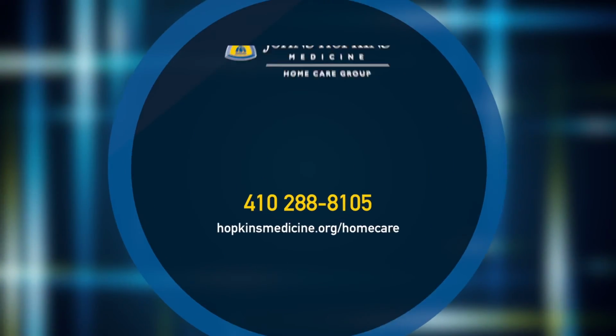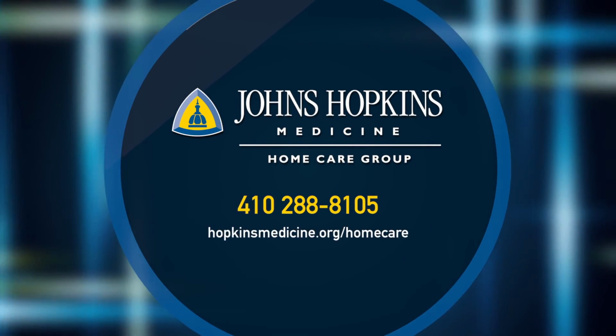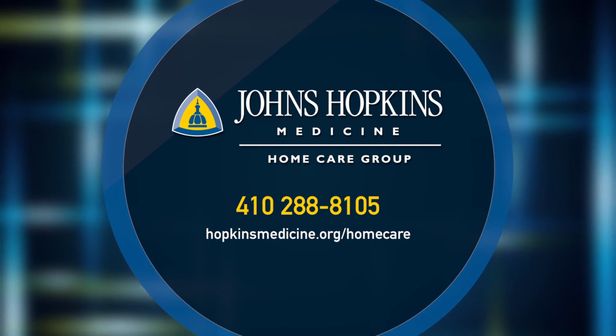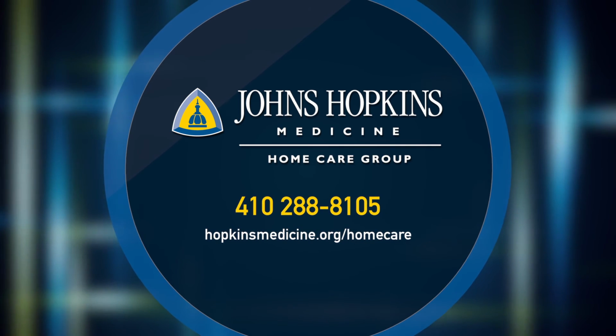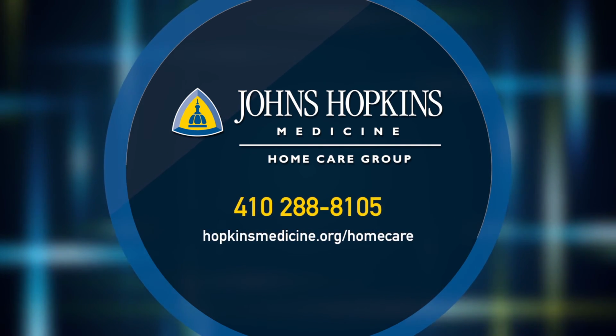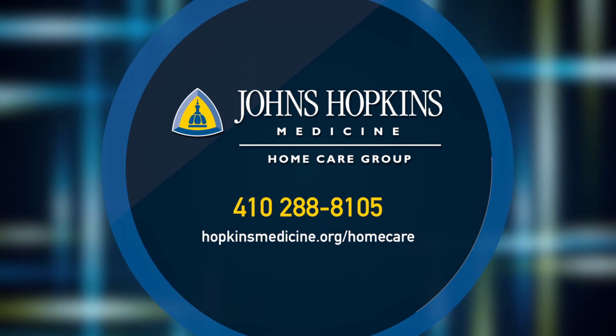The disconnect is now complete. You've taken all the necessary precautions to make sure the patient has received the prescribed chemotherapy, that the medication bag and the tubing has been properly discarded in the chemo bucket, and now the chemo bucket is ready to be picked up. Johns Hopkins Home Care Group is available to answer any questions or to walk you through this disconnect process. Please don't be afraid to call anytime. We are partners in this battle against cancer at Johns Hopkins and at Johns Hopkins Home Care Group too.